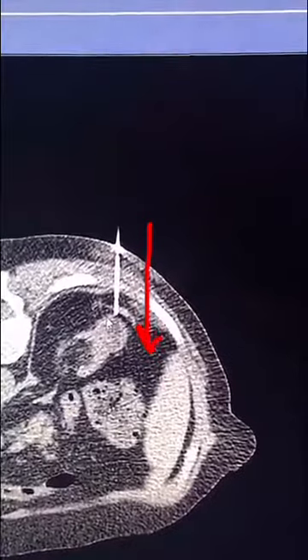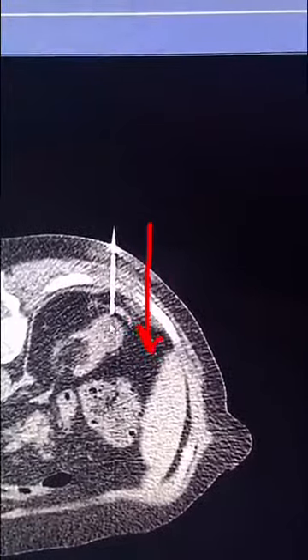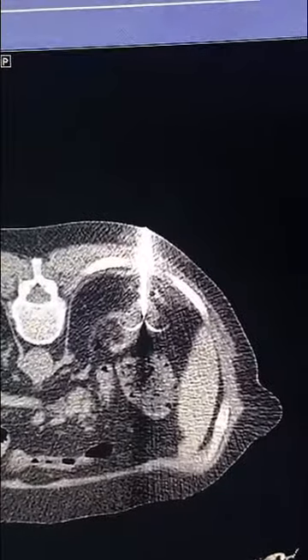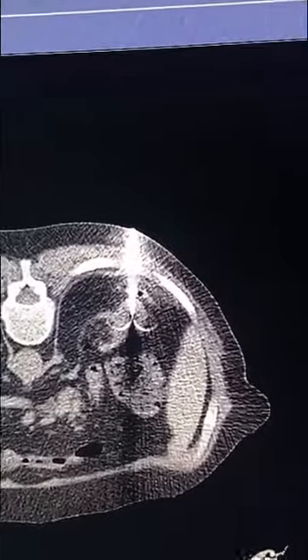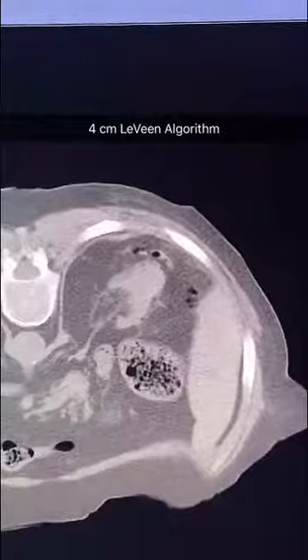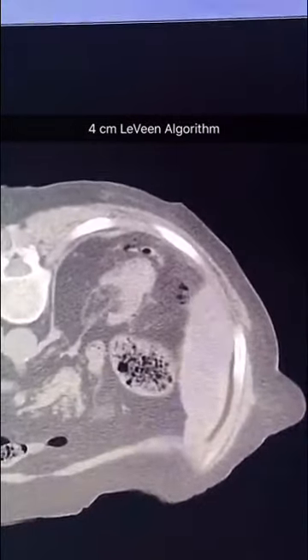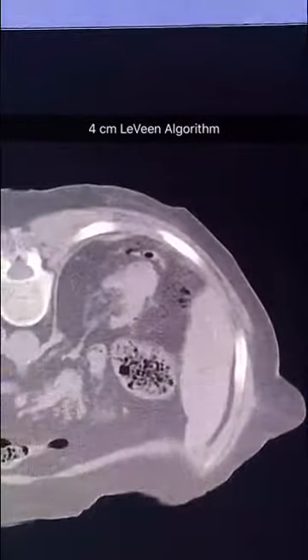After obtaining the biopsy, the coaxial needle was advanced to the middle of the lesion, followed by inserting the Levine RFA needle. As we notice here, the tines are deployed. This was done to confirm the location of the needle, followed by starting the algorithm for RFA. It is a bit complicated, so I'm not going to mention it in this sitting. However, after almost 30 minutes, this is the end result.